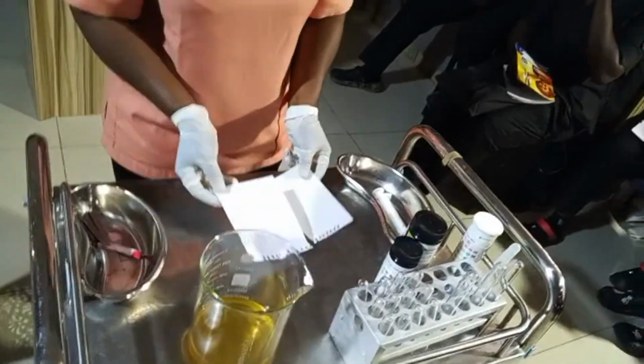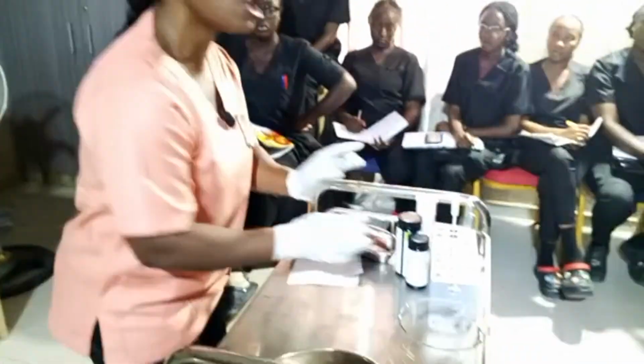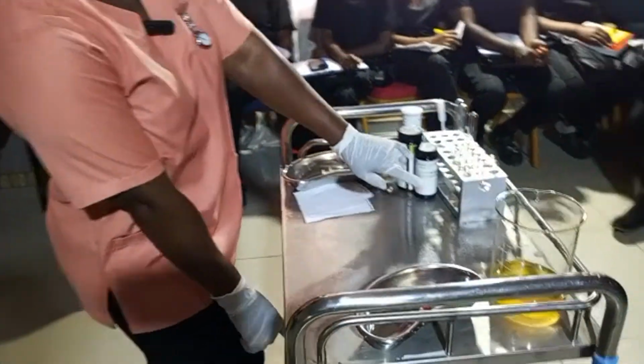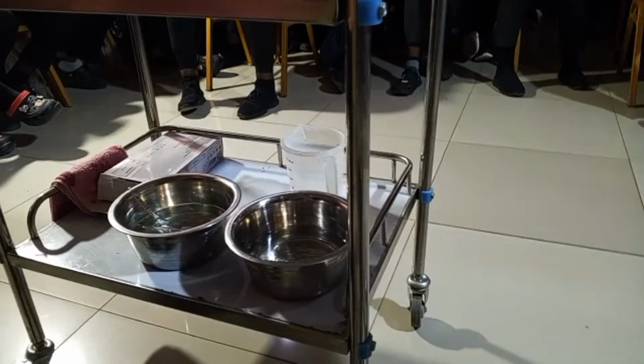So you see, kindly, whenever you are carrying out a procedure like this, always carry out your procedure neatly. And when you are done, what are you expected to do? If it is necessary, you rearrange your used equipment because you have the next candidate that is coming to carry out the same procedure.